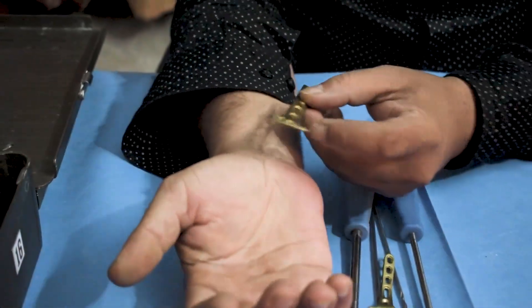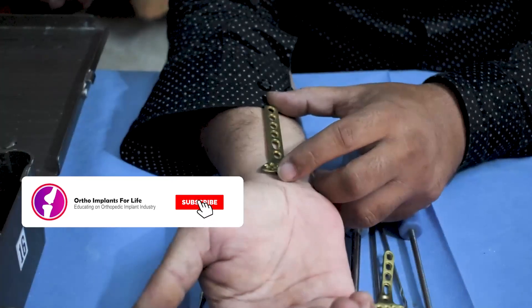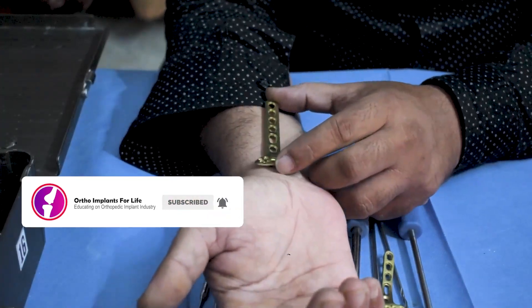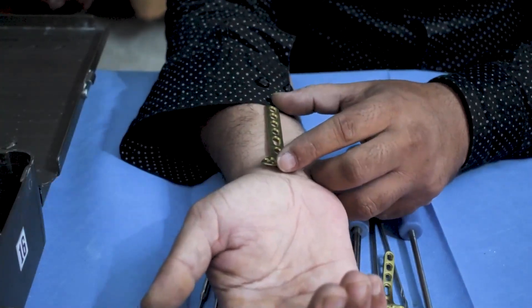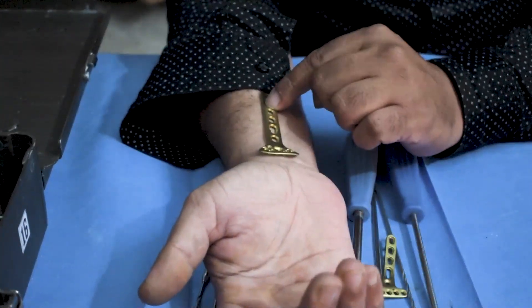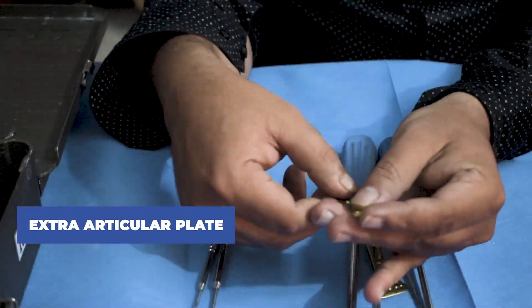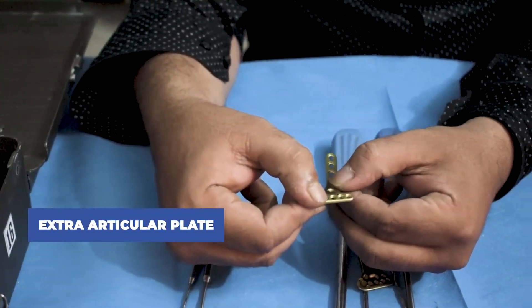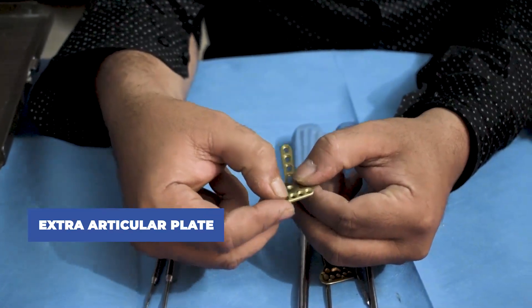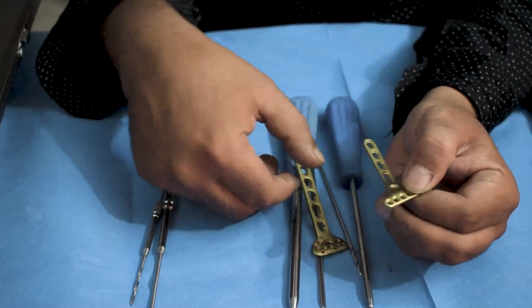For the fixation, the upper side of this plate is a 2.7mm system and the shaft portion of the plate is a 3.5mm system. This is an extra-articular plate and it is entirely a 2.7mm system, meaning it will be fixed with 2.7mm screws.